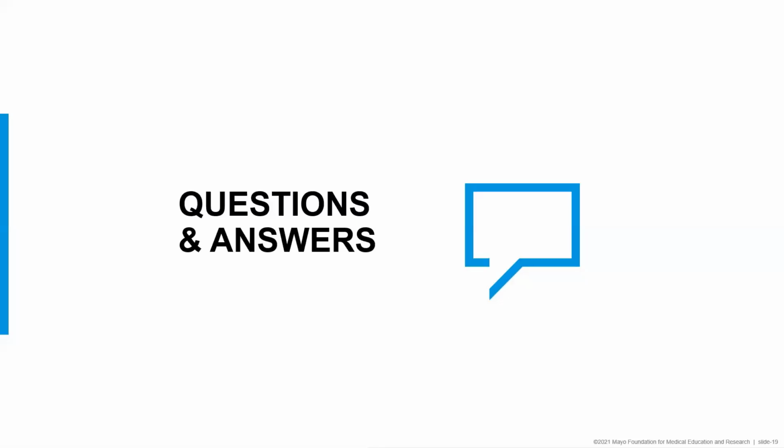So whenever a redraw is issued, we order the new test, the new collection as a redraw. So we can run a report on the redraws, and we get this on a daily basis, and we follow up right away to make sure that we understand the cause of the redraw.